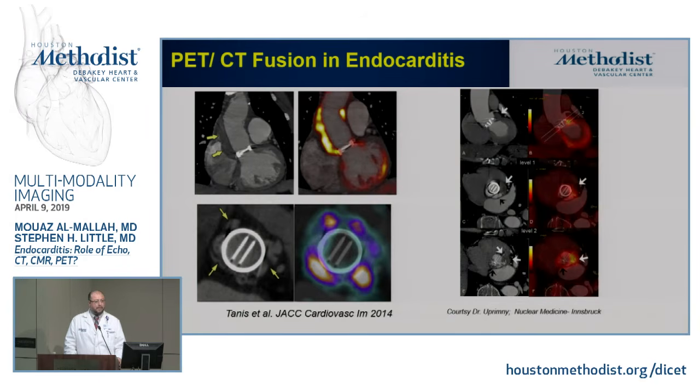Can I make one comment about that? Because this is incredibly important. Especially early post-operatively, you get a lot of fluid collections around grafts and all the rest, and you're not sure, is that infected or is that not infected? Sometimes it's obvious, but a lot of times it's very unpredictable. So this helps tremendously. Yeah, there is a caveat I'll talk about in a few more slides.